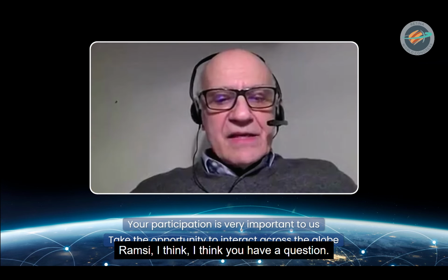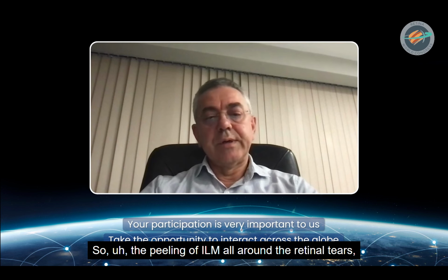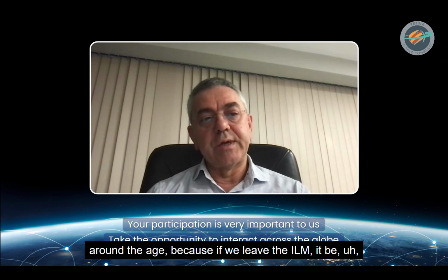Ramsey, I think you have a question. Yeah, Stratos, it's a great case. I congratulate you. So the peeling of ILM all around the retinal tears is an extremely good idea to prevent proliferation around the edge. Because if we leave the ILM, it works as a scaffold, and the proliferation will start around the edge, and the retina may contract or detach.